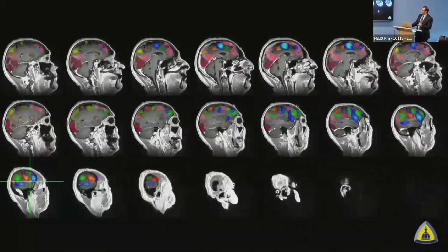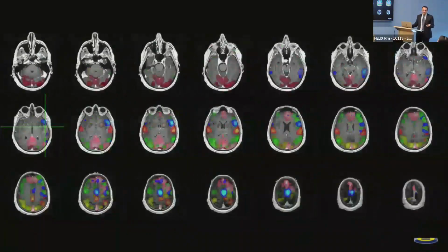And all the other ones, the funny thing is, we don't really know what to do with at this point, because we know they're there, but we don't really know what is the effect of actually resecting that area, because previously they didn't care about it, right? Previously, they were only looking at the orange and the blue here and cutting anything that got in the way of the lesion and then trying to take out the lesion.